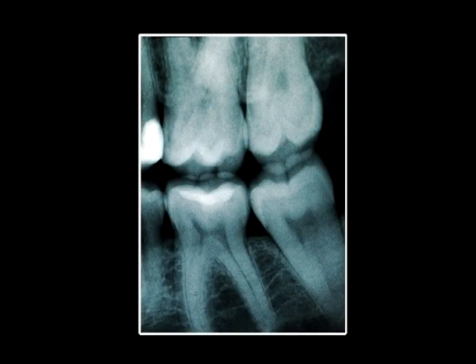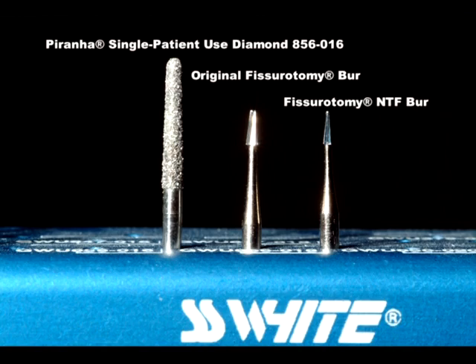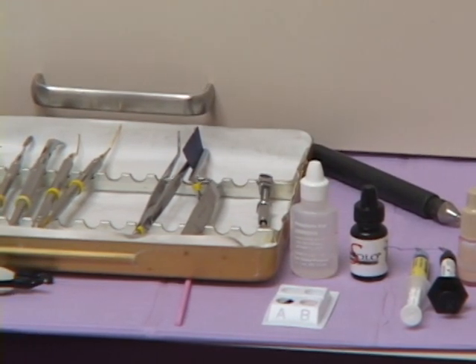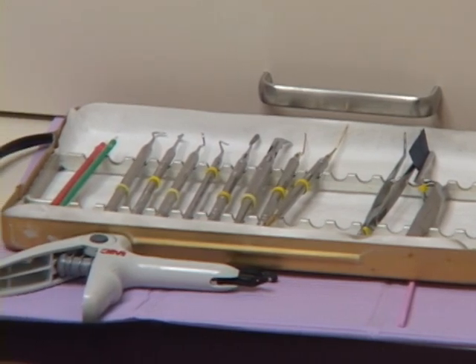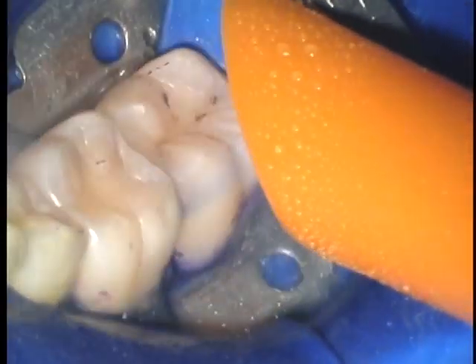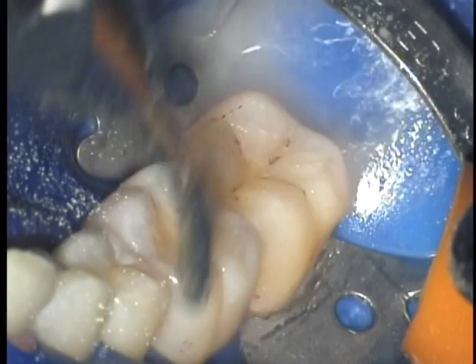As we typically see in posterior teeth like this, there is no radiographic decay present. Next, we apply disclosing solution to aid us in complete plaque removal. Even with a microscope, we find that disclosing solution is absolutely essential. Many clinicians are under the false impression that phosphoric acid alone will clean the tooth and remove bacteria — it does neither.